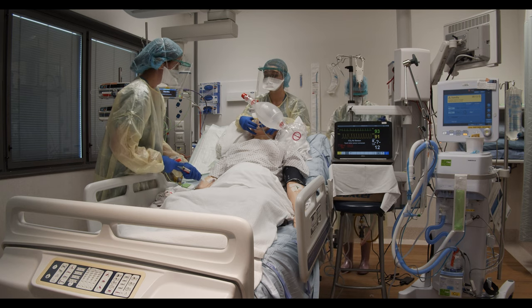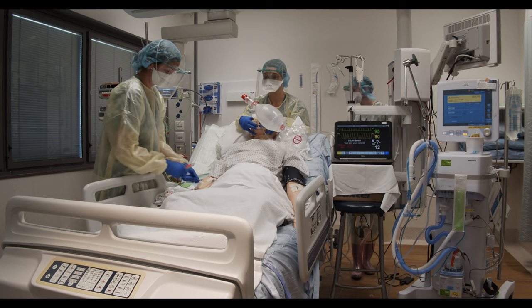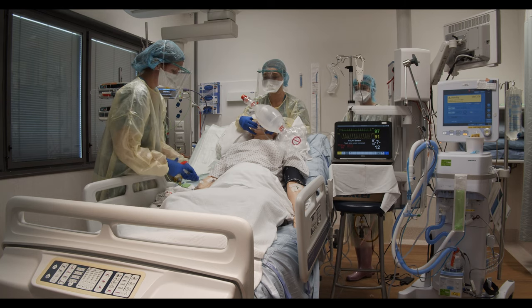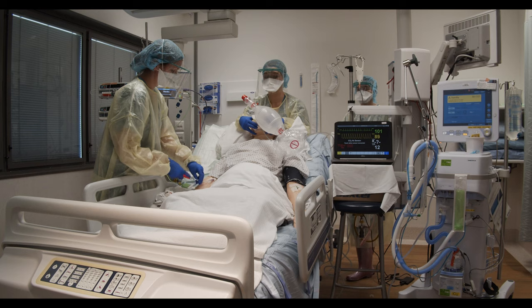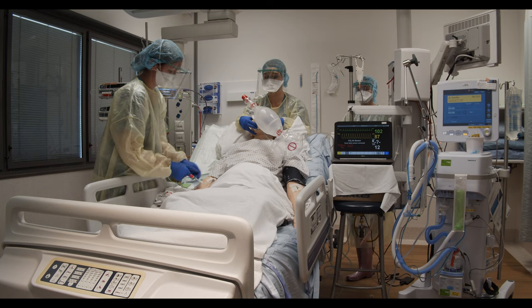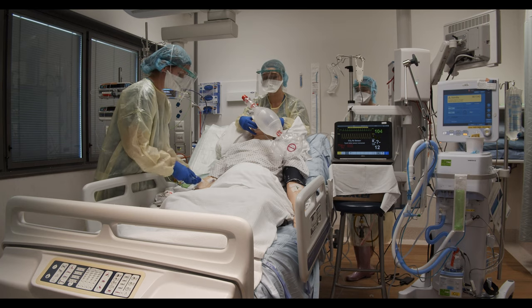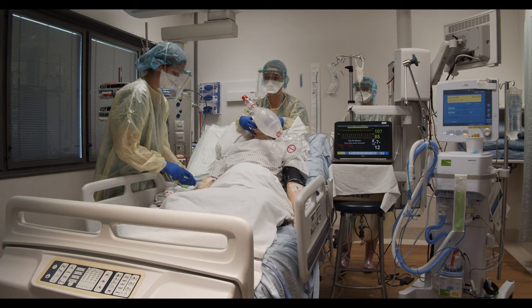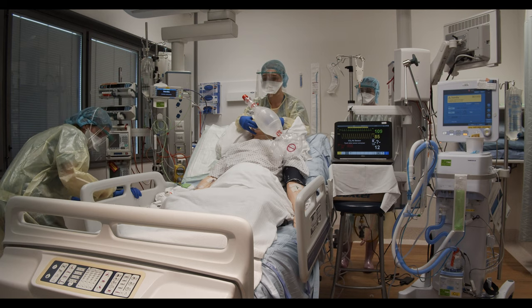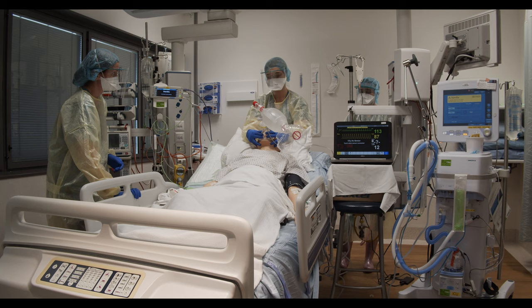Okay, so we're just going to get you off to sleep now. Going to give 160 of ketamine, followed by 100 of rocuronium. Start the timer. Okay, and then when you're ready, Sarah, you put the head down. Once the drugs have been administered, you can then use this time during induction to reposition your patient, to lower the head of the bed and position the patient appropriately for the intubator.